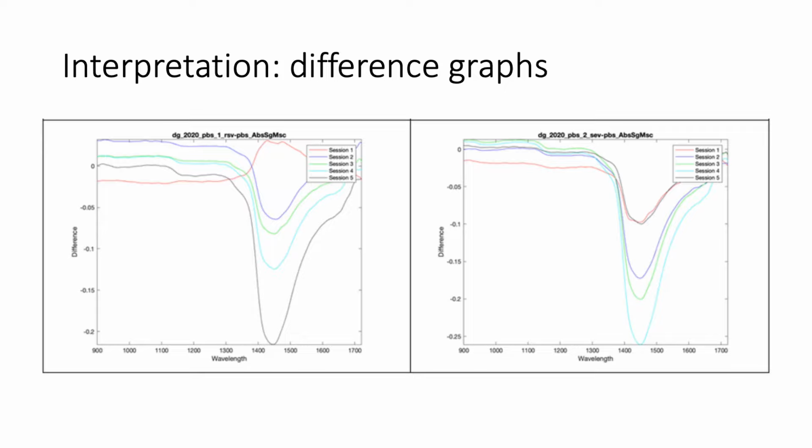The first column lists validation results on the training data. The second column lists prediction results on testing data. You can see the corresponding result values are quite close, suggesting overfitting is low. So this also means that the prediction result should be fairly reliable. The third column lists RSV sensitivity values, and the last column lists SEV sensitivity values.